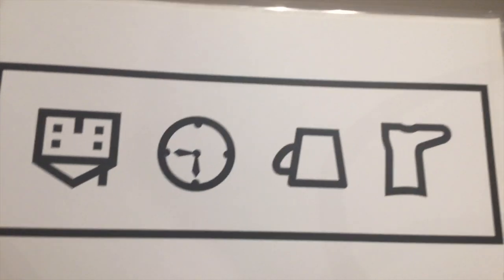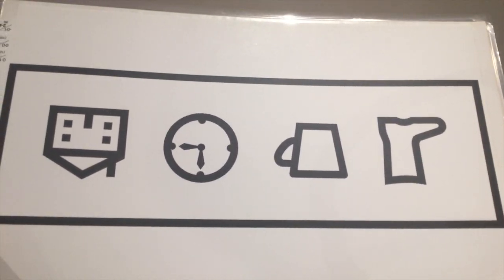Okay, flip over again. Now we're going to 4 pictures. You know, it's crowded, we've got the bar around it as well. And here, facing us, there we are. If they get 4 correct, their acuity is 0.8 logmar. Right, and so on.